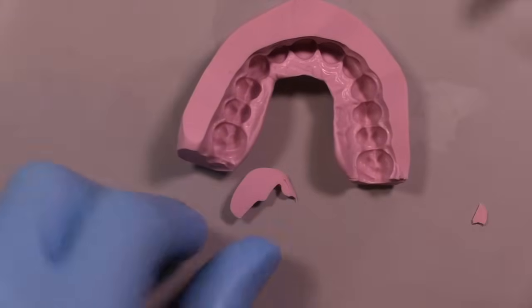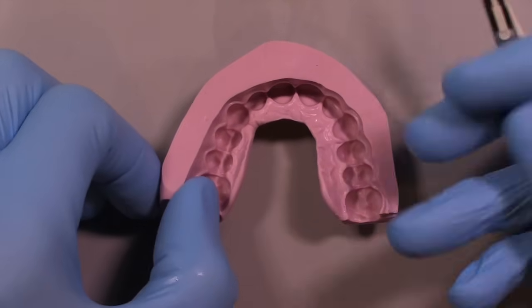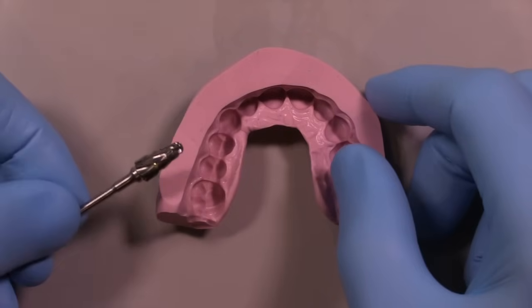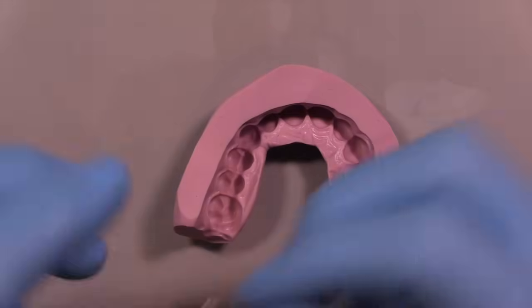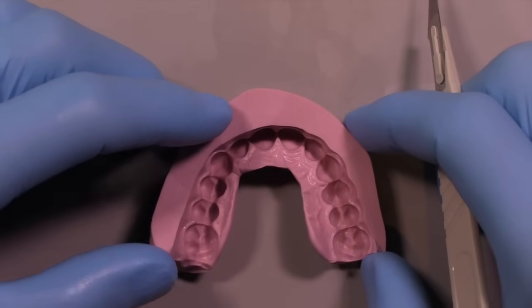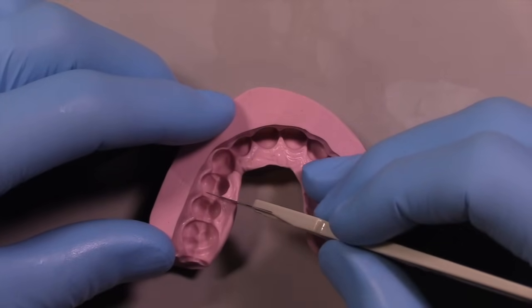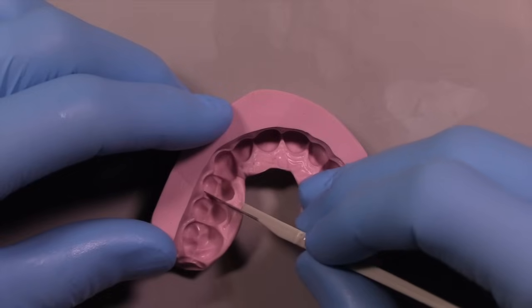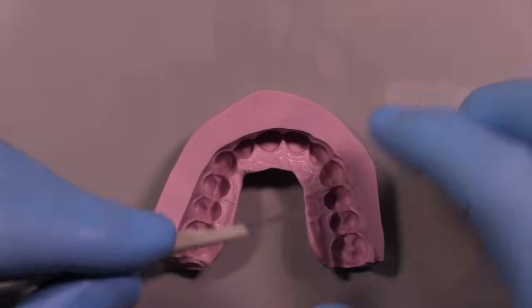I'm going to remove some of the distal portions just to make the prep guide a little bit more symmetrical — it makes it easier to go in and out of the mouth if it's symmetrical. We're going to even out the thick area along the facial using a coarse acrylic burr to trim off a lot of that excess. You can even use this on the model trimmer — surprisingly, you can make them very smooth that way. I'm going to make a couple of incisions, one between the premolars on each side, going from the facial towards the lingual.